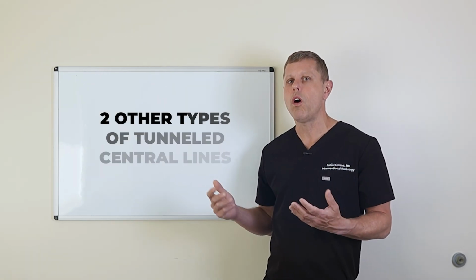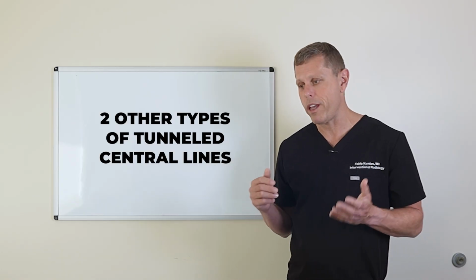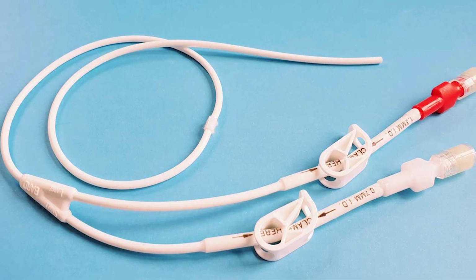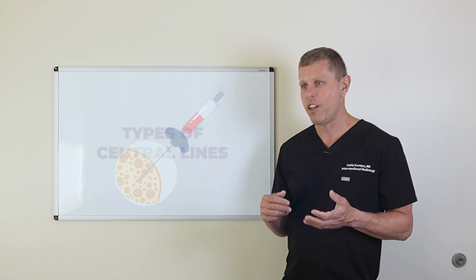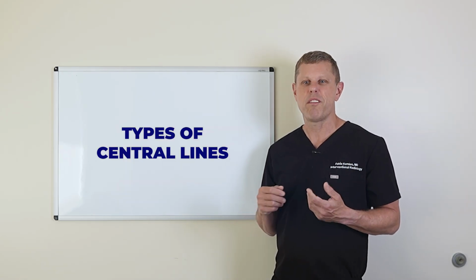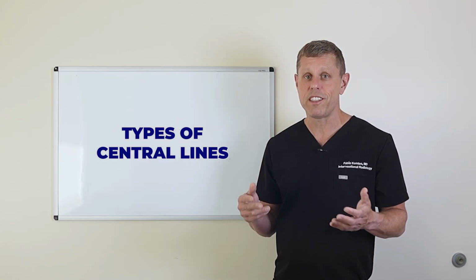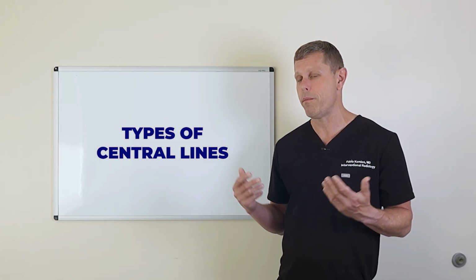Now, there are two other types of tunnel central lines that are a little bit special and you may hear about. One is called a Hickman catheter. A Hickman catheter, most of the time, is only used for patients that are getting bone marrow transplants these days. And it looks like a tunneled central line, except that it's a little bit bigger. Instead of being 1 to 2 millimeters, it measures about 3 to 4 millimeters and is used for patients that require a bone marrow transplant. That's the only use that I've used in the past few years.